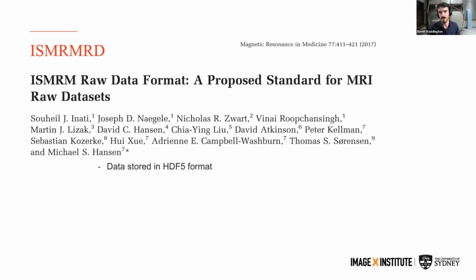Really, it's data stored in one of these HDF5 formats. There's an XML header, and then there's a raw data section that's more or less just a struct or a matrix of data.